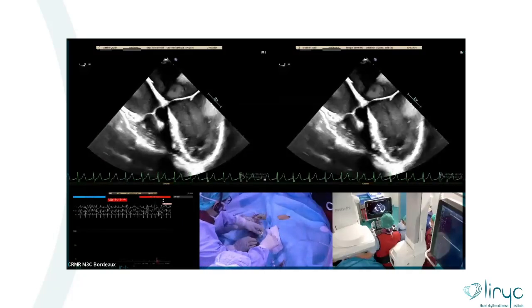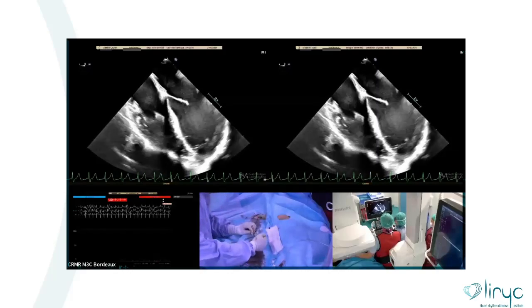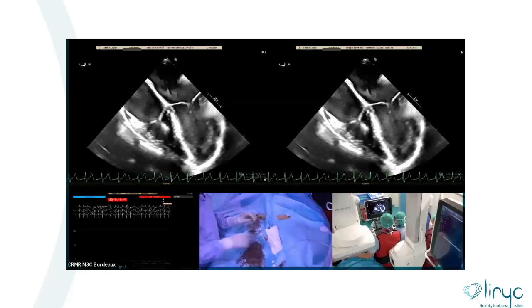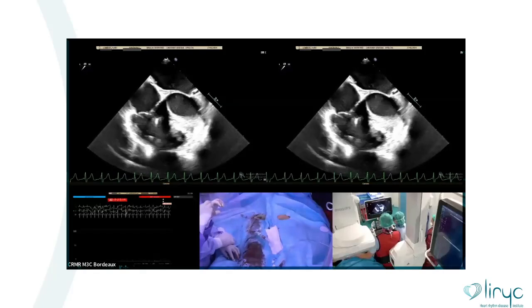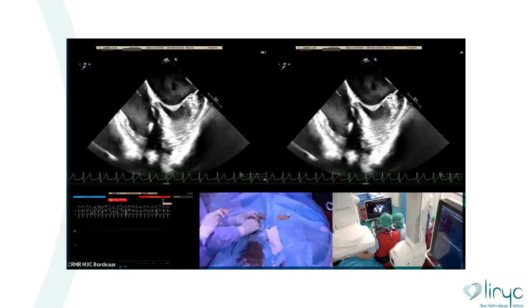Even if we measure the pressure with saline, we also should be careful if the delivery system just passes a little. So contrast in the RV. Wait a minute. Sometimes we have the problem that the delivery system just touches the VSD. It hasn't passed enough. If you inject something, you can find the bubble.